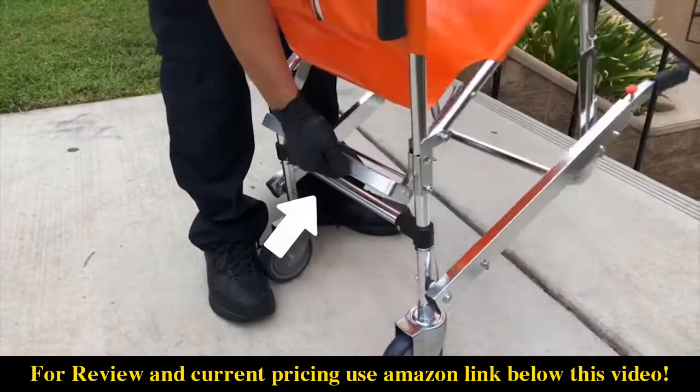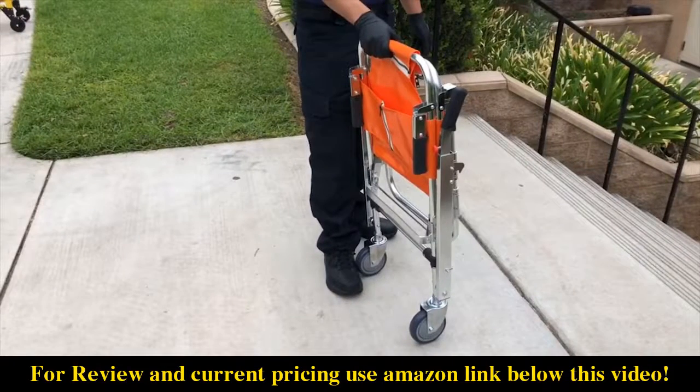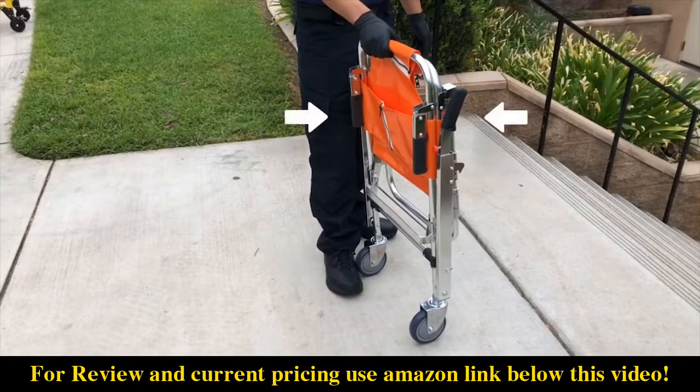To fold, pull upward on the center of the lock bar to disengage the lock and pull the seat frame up until the chair is completely folded. All carrying handles must return to the starting position.